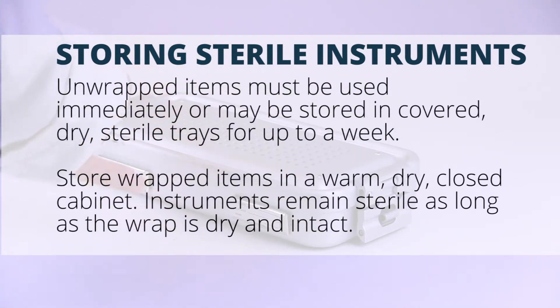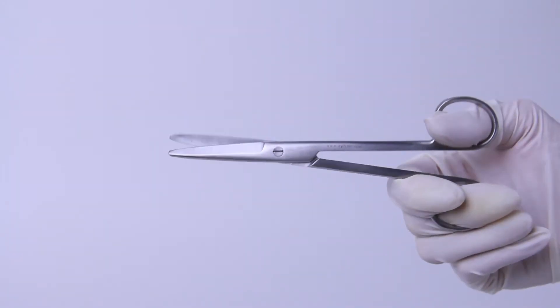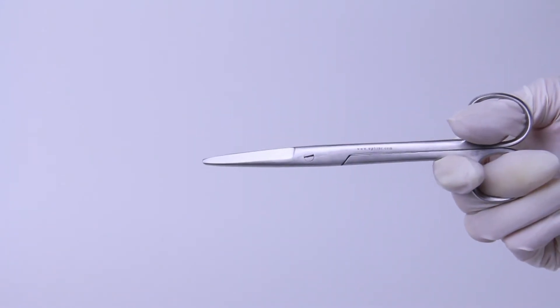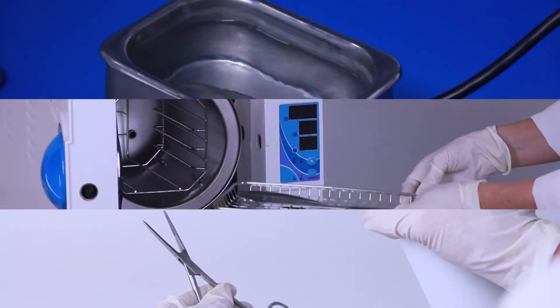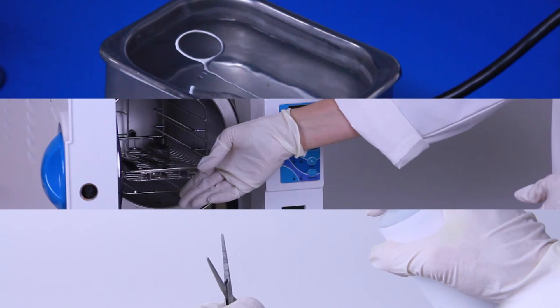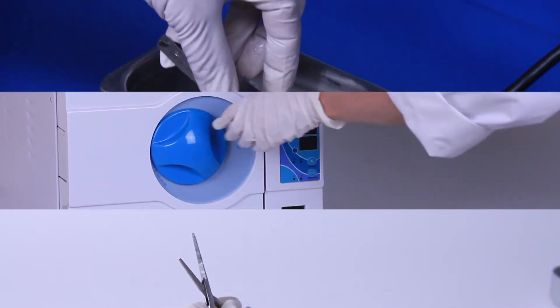Store wrapped packages in a warm, dry, closed cabinet. Instruments remain sterile as long as the wrap is dry and intact. With proper care and maintenance, your instruments will last for years to come. Understanding the difference between cleaning, disinfecting, and sterilizing can safeguard your research and protect your investment in surgical instruments, equipment, and laboratory animals.